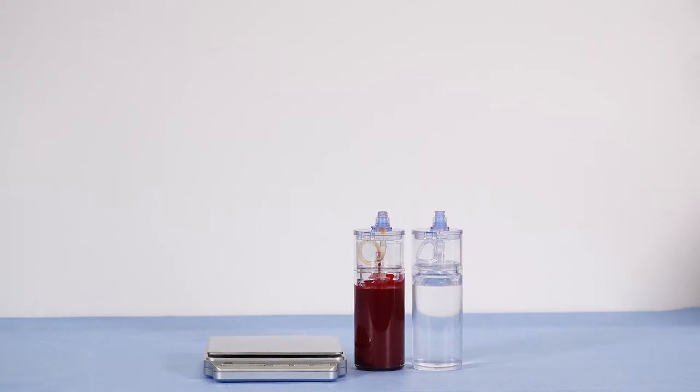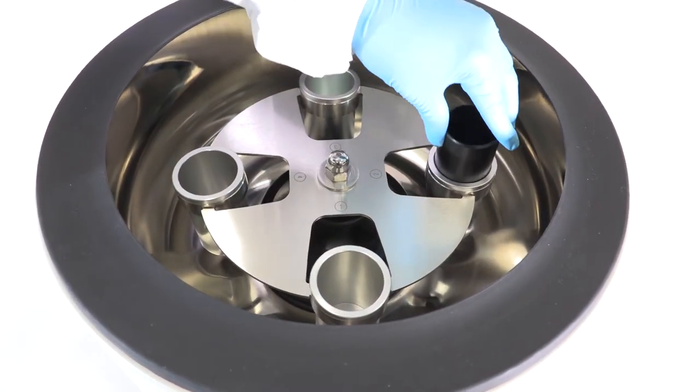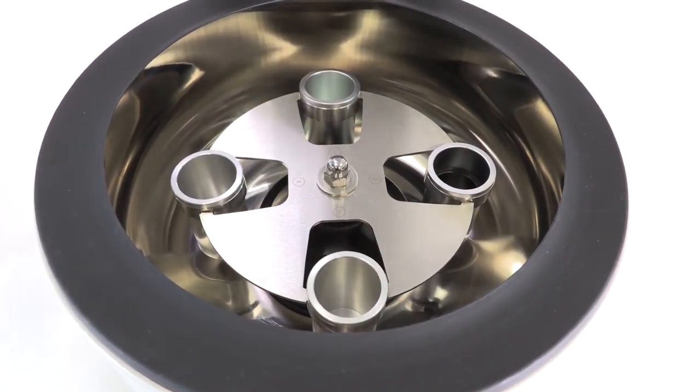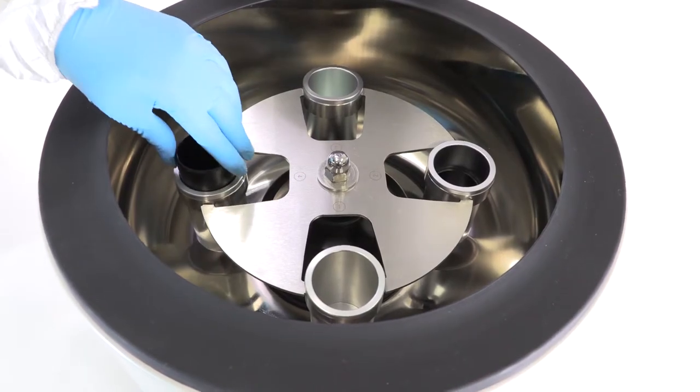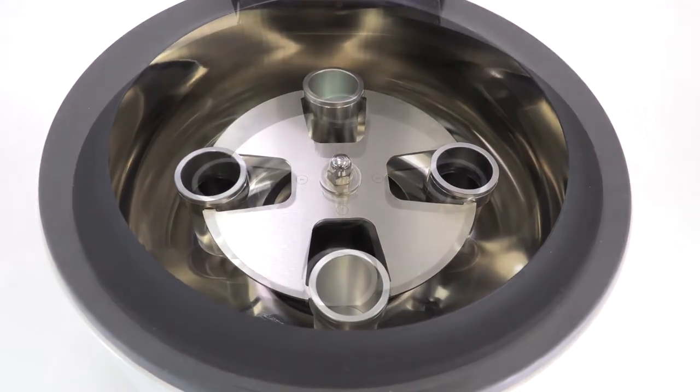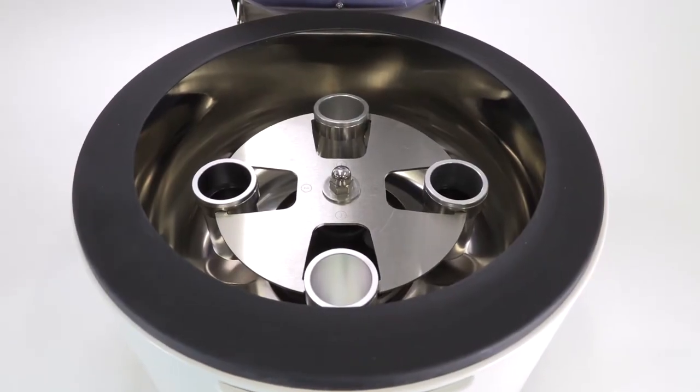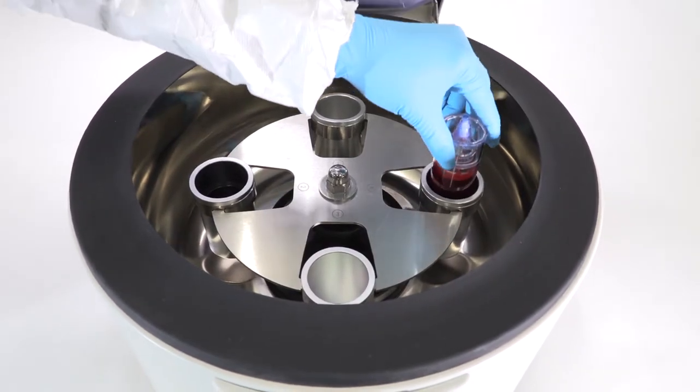Use the counterbalance device to counterbalance with equal volume. Place the thin inserts in the buckets as shown, and then place both devices in the centrifuge rotor at opposite ends.